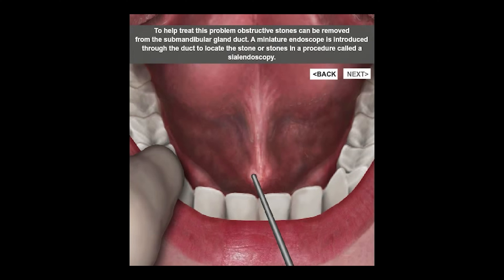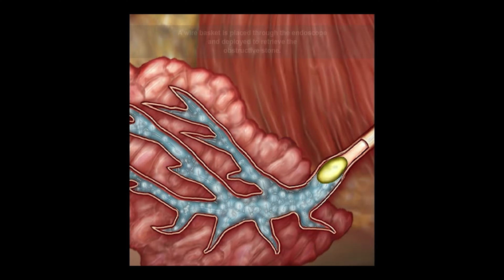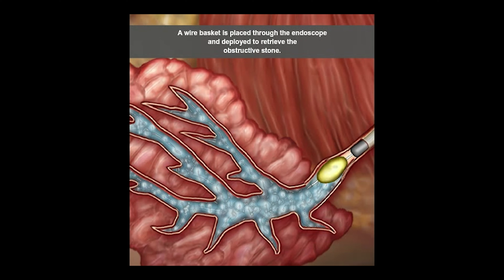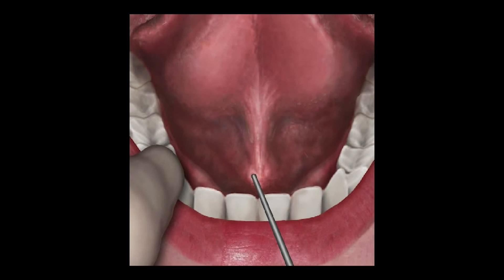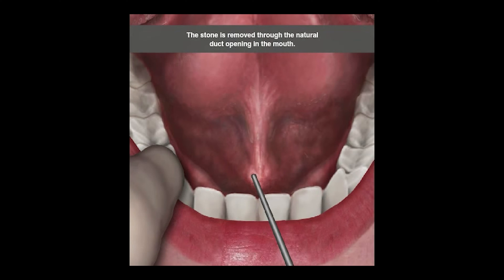Here we see the stone that's blocking the saliva. We open and deploy a basket, grab the stone, and pull it backwards out of the duct and through the natural opening. This requires no incisions — it's a very natural process and the saliva is able to discharge through the normal opening under the tongue.